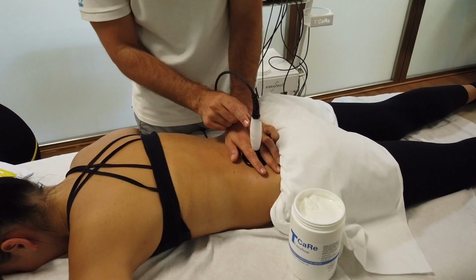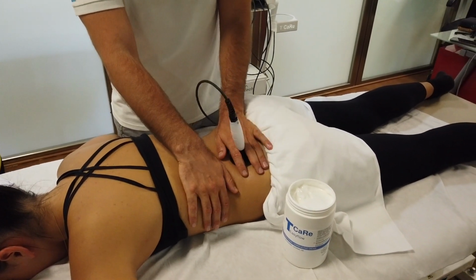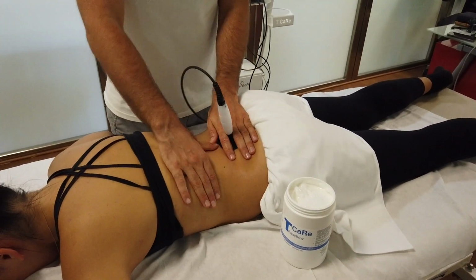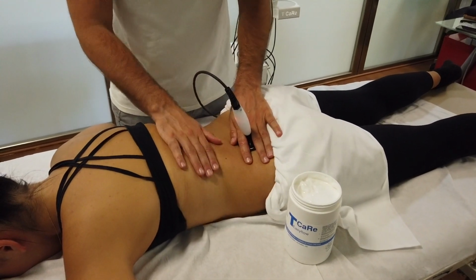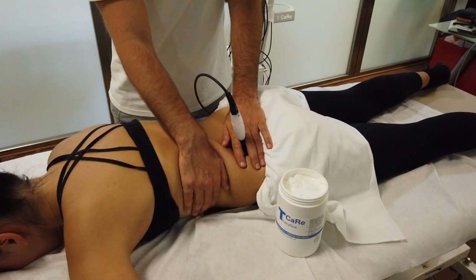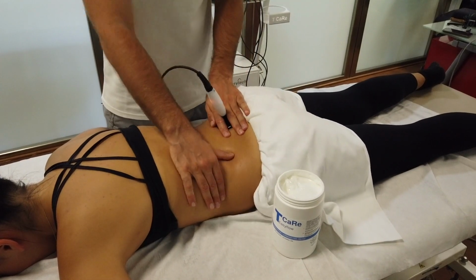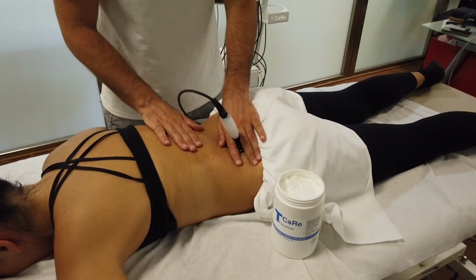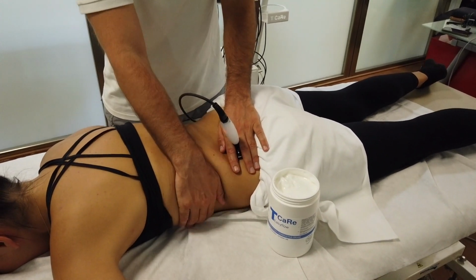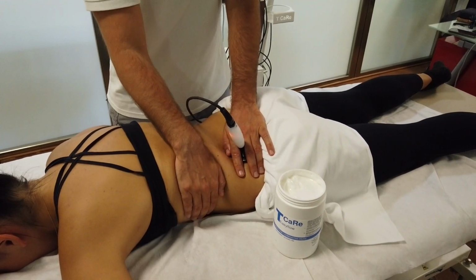Now I'll show you the pulse mode, as you can see in the piece, and this type of treatment allows me to treat in a fixed position and create a mobilization of the articulation. So I can stay for 3-4 seconds in the same position, avoiding burning the patient.